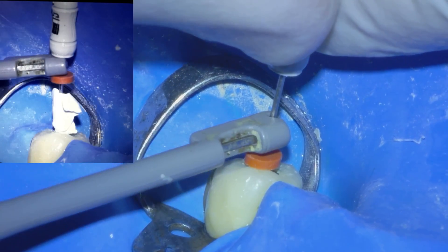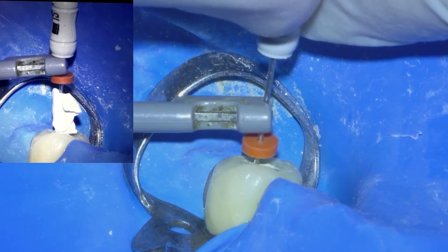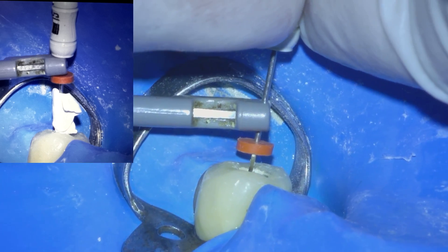Another way is to coat the part of the file that can contact the metal with PTFE tape, and then the apex locator will work correctly.